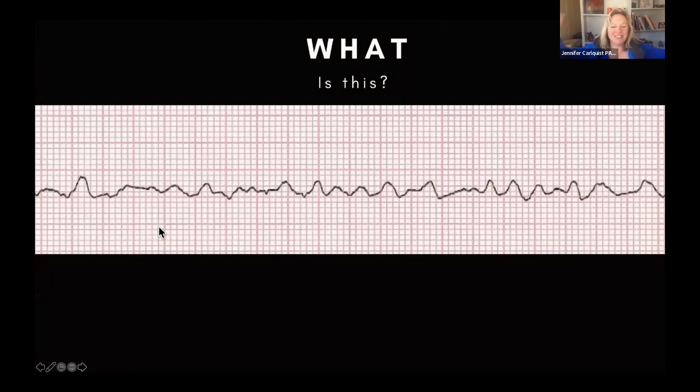This is what? Okay. Oh my gosh. Good. We have some folks chiming in. Yeah, good job. So everybody's saying this is Vfib. Okay. That's an easy one. We know because it's got this irregular pattern. Yeah, good. Anoop says Vfib as well. So everybody scored on that one. That was an easy one, right? That was kind of a slam dunk. Good job, Anne, on Zoom as well.